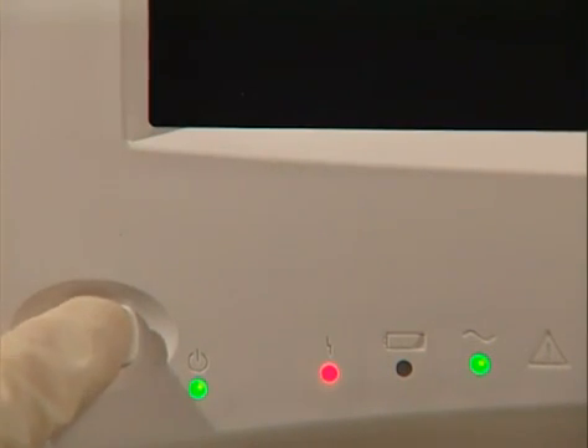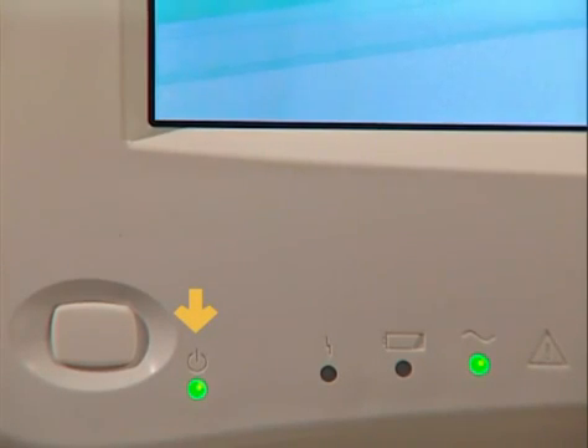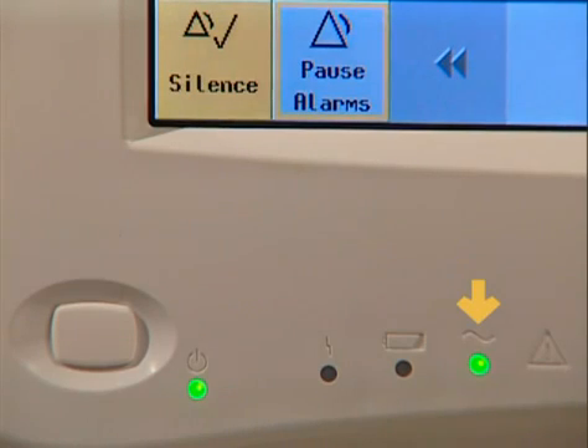Press the power button and the monitor powers up. This LED indicates the power is on, and this one indicates it is connected to AC power. If the monitor were operating on battery power, this LED would be lit. This is an error LED — if it's lit, then there's a problem with the monitor.